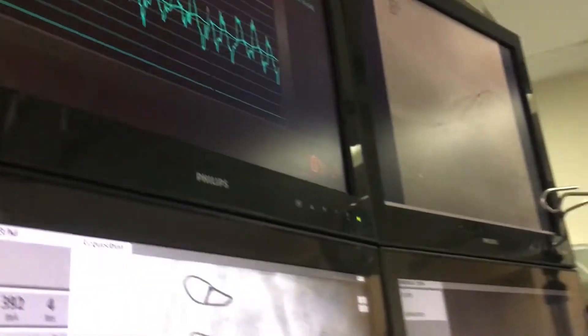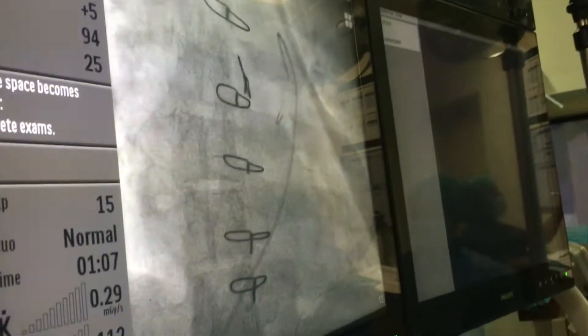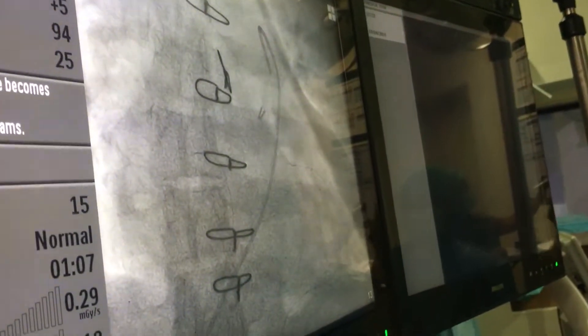For this patient, systolic 38, diastolic 16, and mean 26. Okay, fine. So we have measured PA pressure. Now we are okay. So this is not very elevated. Okay.